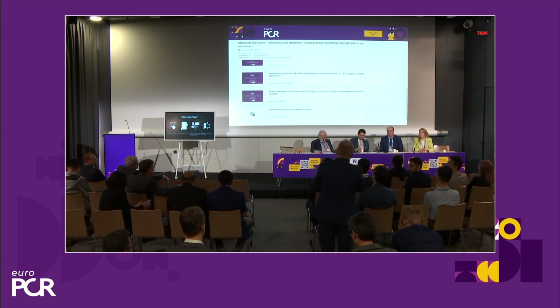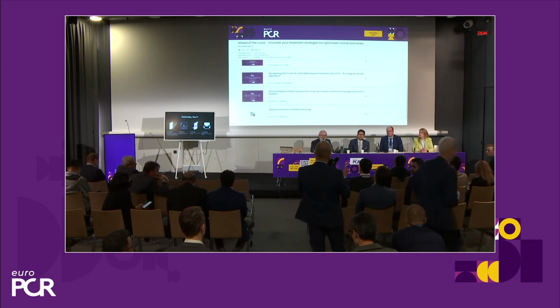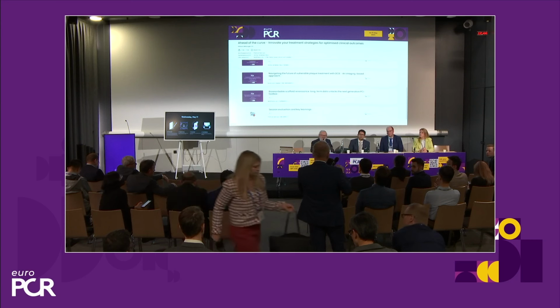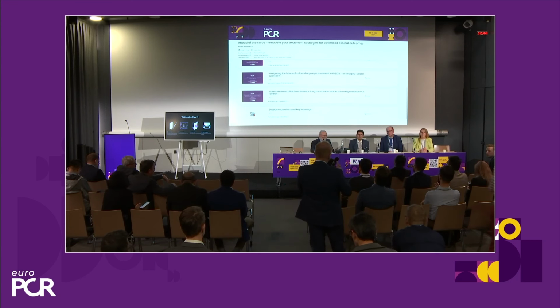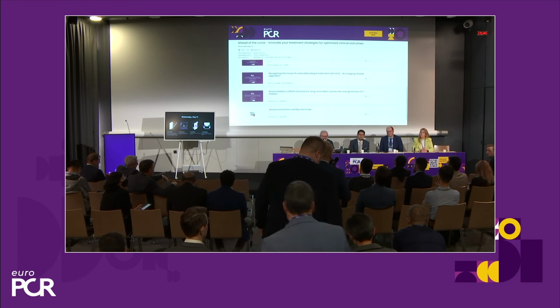I'd just like to ask about the crystalline form of sirolimus. Assuming that it's not bioavailable in the crystalline form, do you have an idea of what the bioavailable concentration is in the tissue? And secondly, how long does the crystal survive in the wall, and so how long would that effect persist?